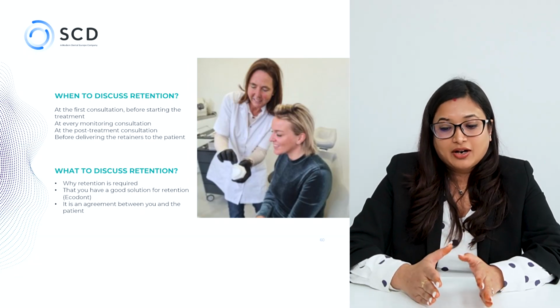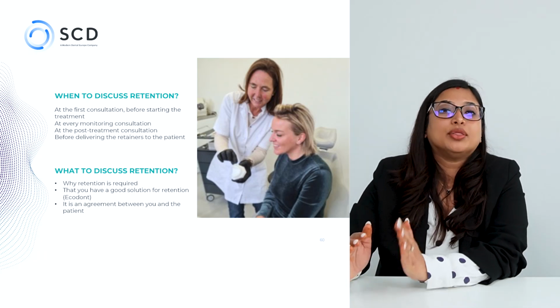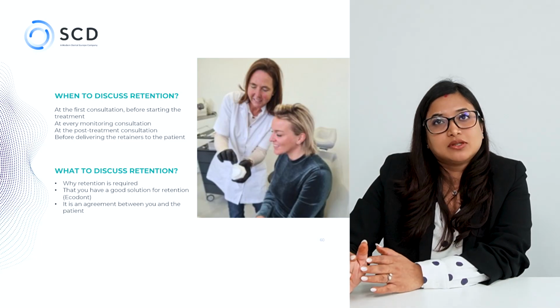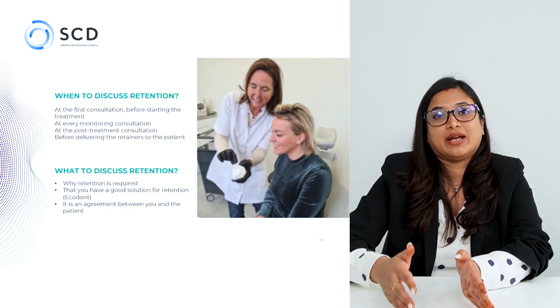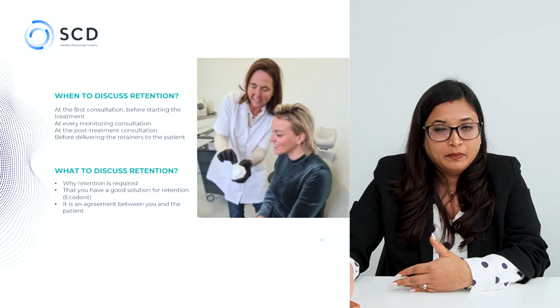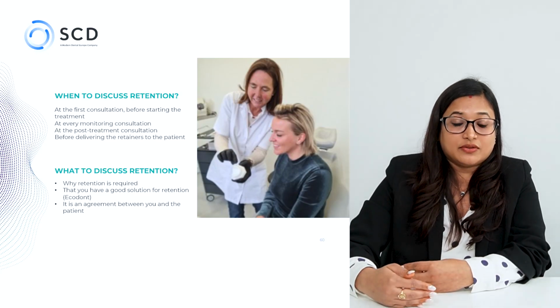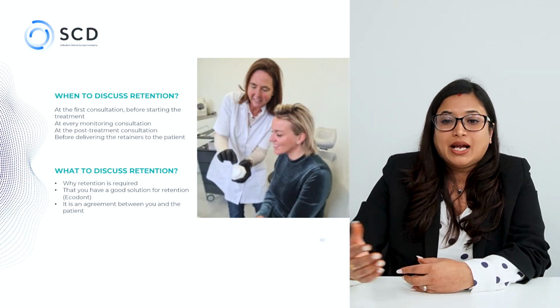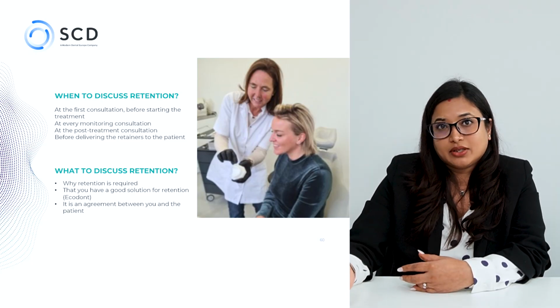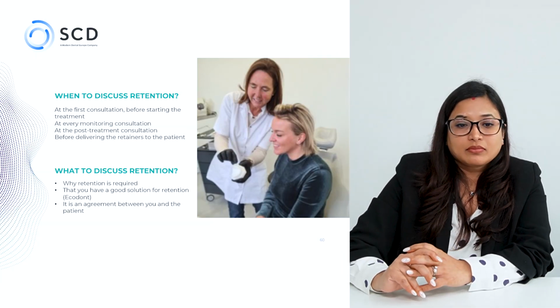Retention after a treatment plan in orthodontia has to be discussed with the patient on the very first day, at the consultation itself, because sometimes patients are not aware that they have to wear the retainers for a substantial period of time after the treatment is over. So we have to highlight to them that after the treatment is over, they still have to wear the retainers for a certain period of time. At every monitoring consultation, emphasize it again. And at the post-treatment consultation, when you're giving the retainers to the patient, indicate it again to them.